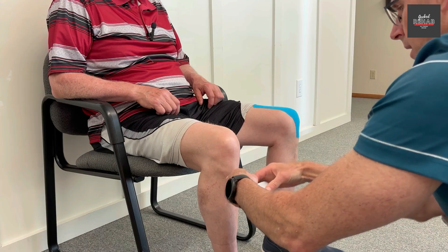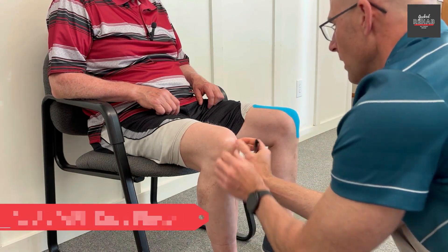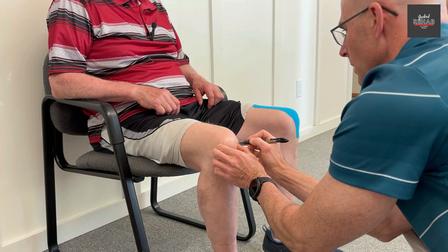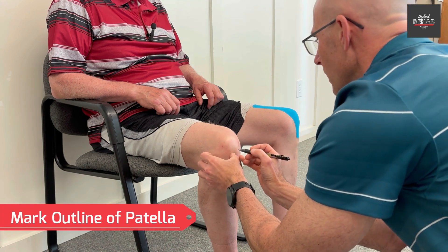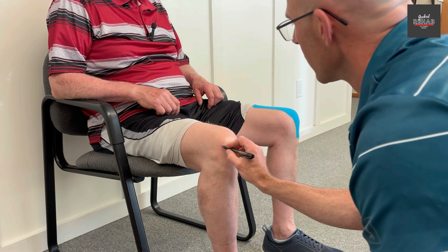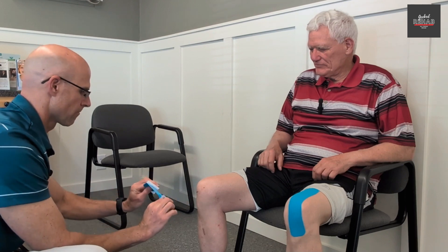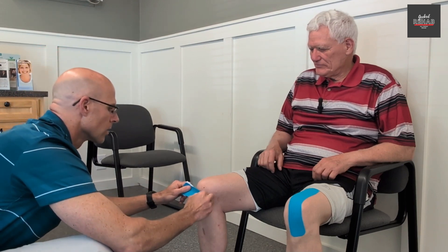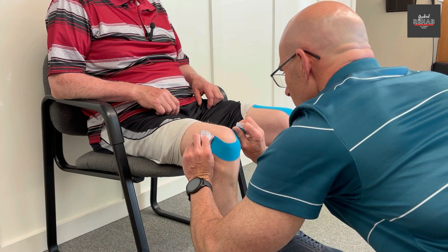I pre-cut a piece of tape. You want to put this on in a bent position as well. Oftentimes I'll outline the kneecap so I can get an idea of where to place it and make sure I cover it. I get my targets — we're looking at the bottom of the kneecap right there. I try not to touch the tape. Get the ends and apply a little bit. That's the inferior part of the patella — I try to get just a little bit above it and then give an upward force so it lifts.